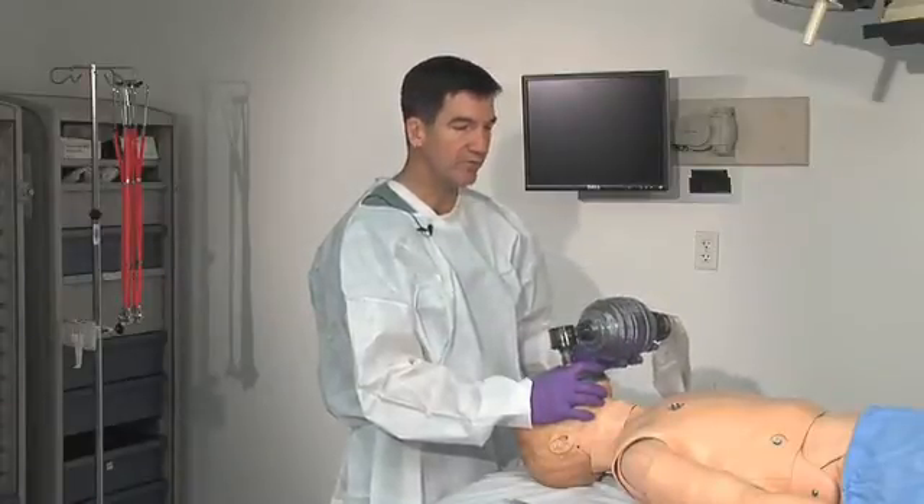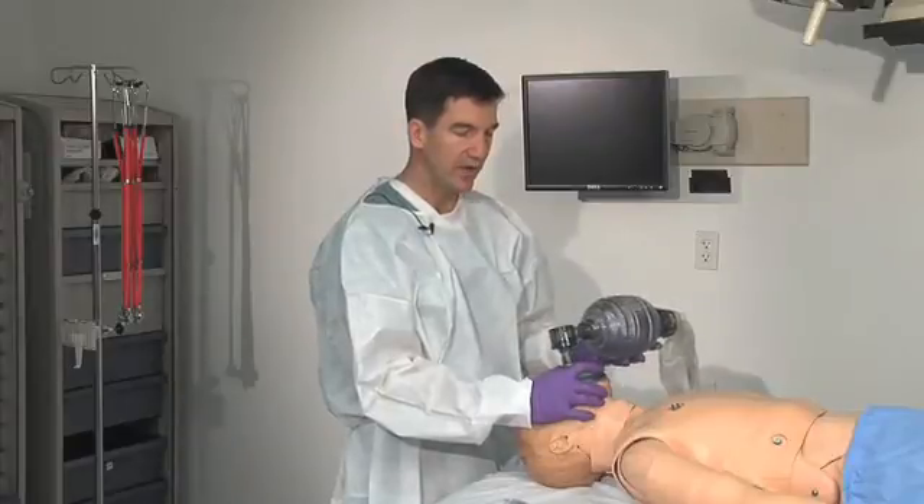With a good seal on the face I watch for rise and fall of the chest. Ideally we'd have pulse oximetry on at the same time, so I'd want to watch to see an increase in the pulse oximetry.